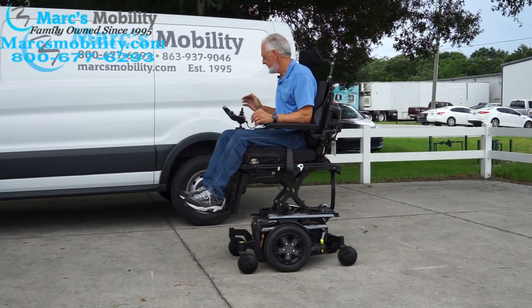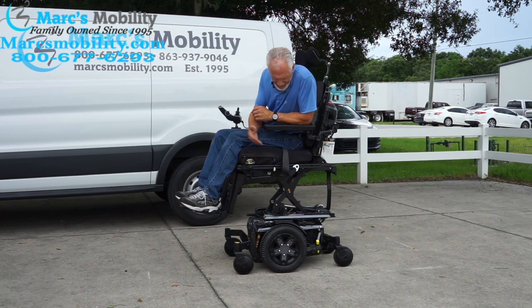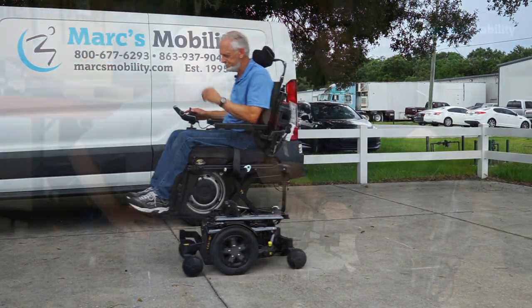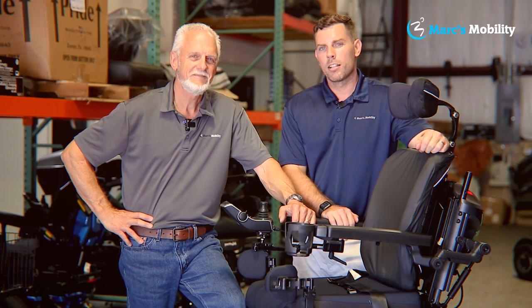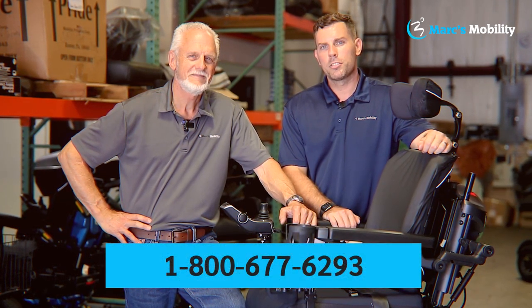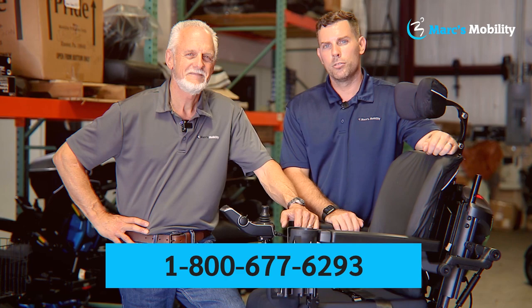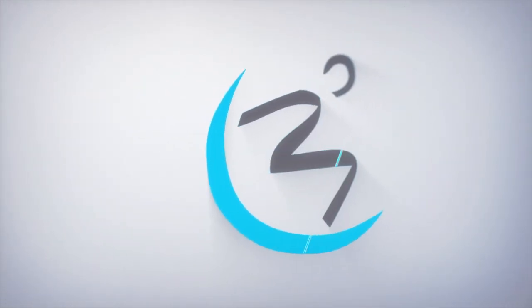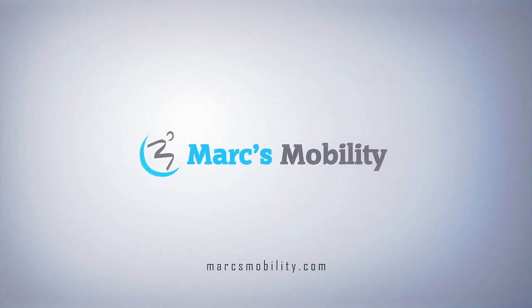So if you're looking for a nice power chair with 8 miles, the 12-inch seat lift, electric tilt, electric recline, electric feet, and headlights on the fenders, this would be a great chair. Hi, I'm Mark and my name is Alex — we're co-owners of Marc's Mobility. I started this company in 1995. We sell many products beyond what you see in this video. If you have any questions or concerns, please call us at 800-677-6293. Thank you and have a wonderful day.